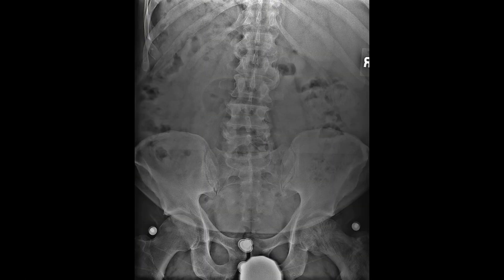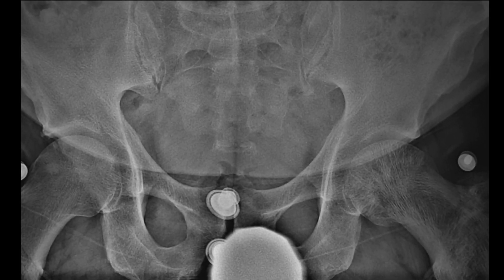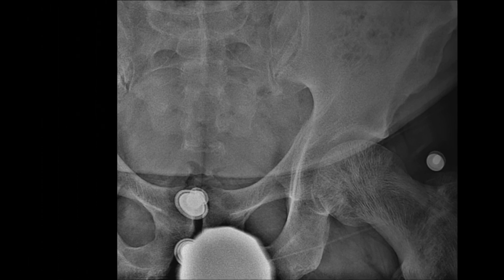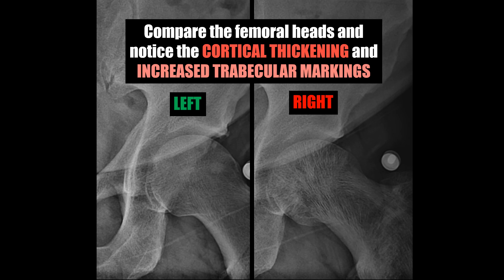Here is a subtle case of cortical thickening seen in early Paget's. Take a close look at the femoral heads — compare both and notice the cortical thickening and increased trabecular markings seen on the right.